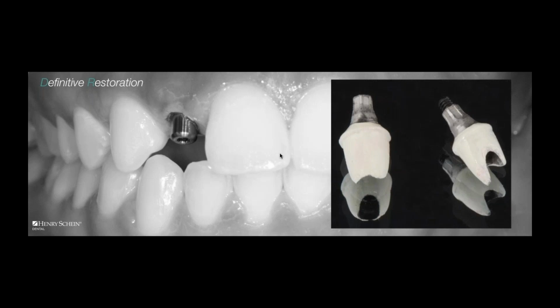Then I had to pay for waxing, investing, burning out. You guys remember those terms? Slinging molten gold, platinum, palladium, stacking porcelain to create a custom emergence, custom margin, custom opaque. And before you know it, these two abutments are the most expensive abutments I've made in the last 10 years of clinical practice. And I lost money on the case.